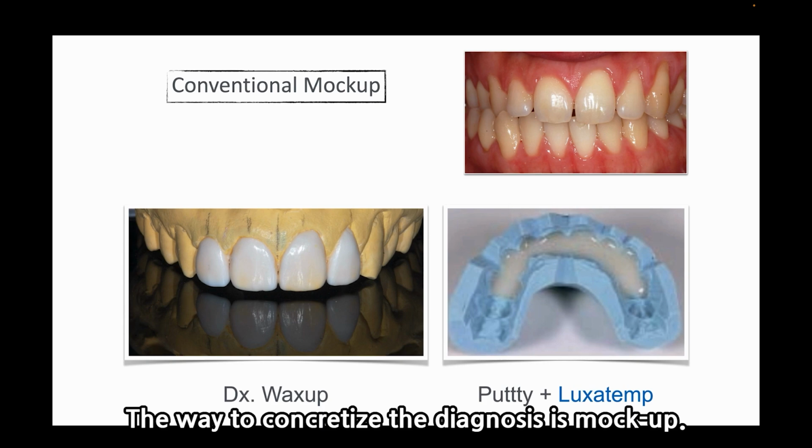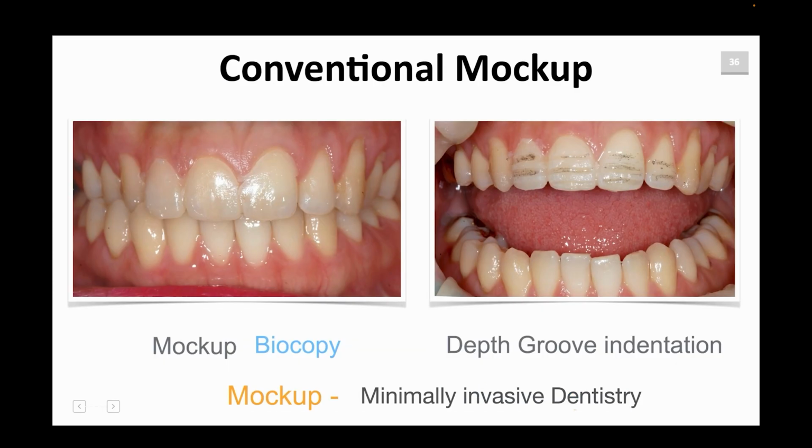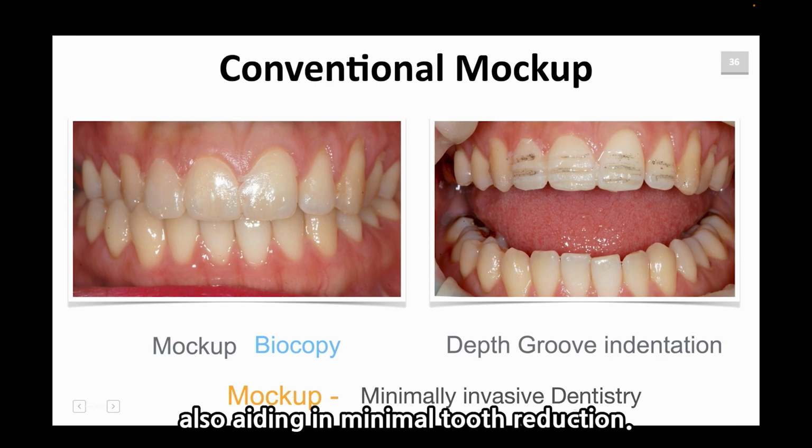The way to concretize the diagnosis is a mock-up. This is an analog mock-up using a silicone index. It helps communication with the patient and enhances the dentist's understanding of treatment, also aiding in minimal tooth reduction.